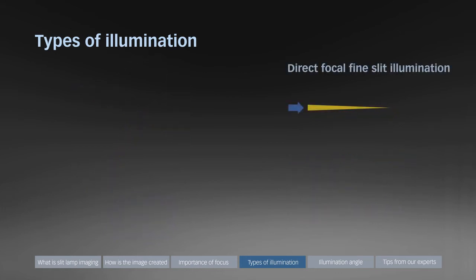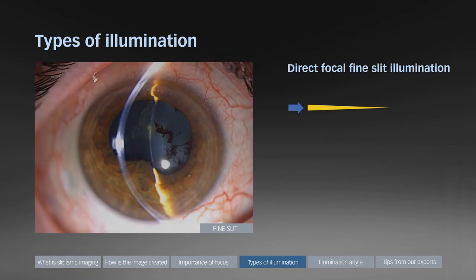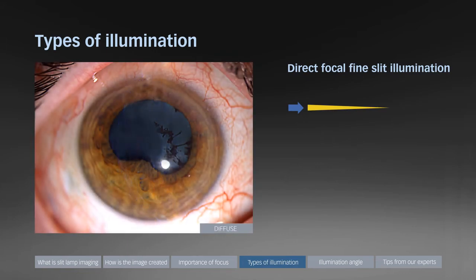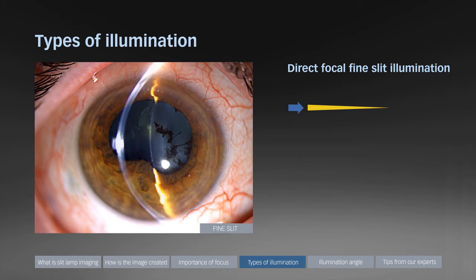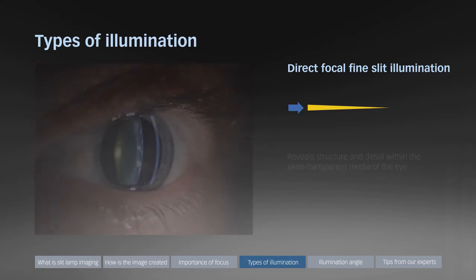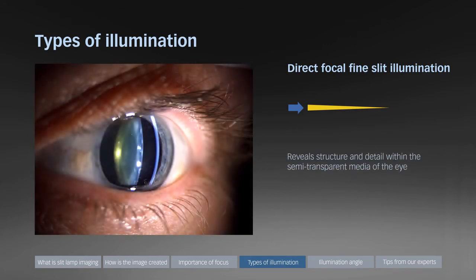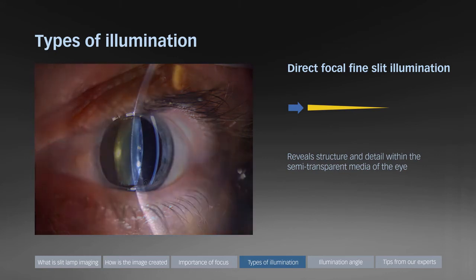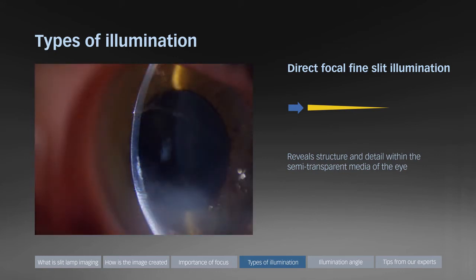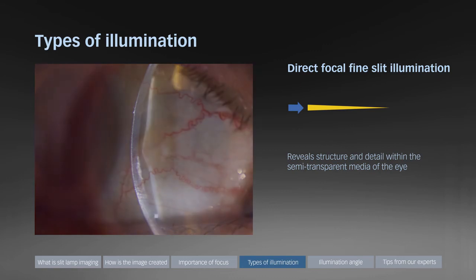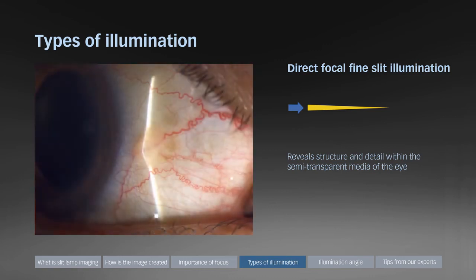Direct focal fine slit illumination delivers a narrow high intensity slit beam. For comparison, the same eye with diffuse illumination only and here again with direct focal fine slit illumination. Fine slit illumination can be used to reveal structure in detail within the semi-transparent media of the eye. It also assists with locating the level where pathological changes occur and finally allows visualization of topography.